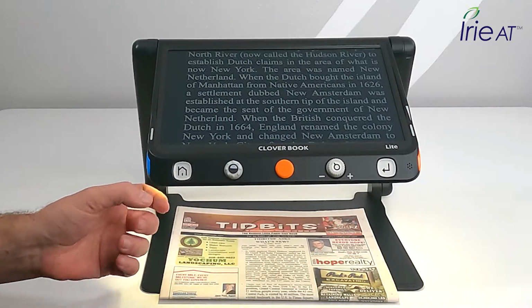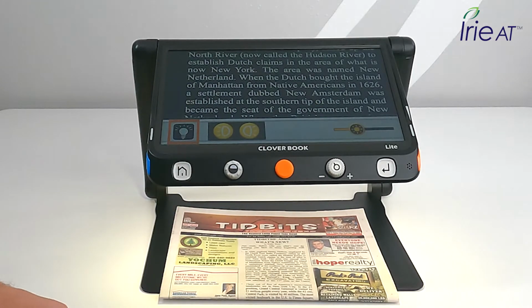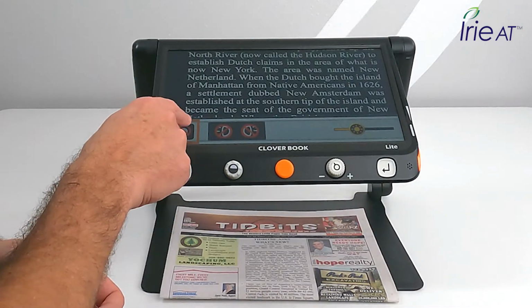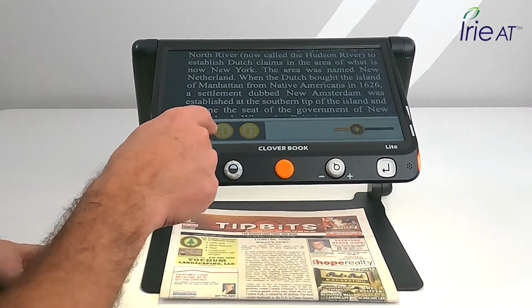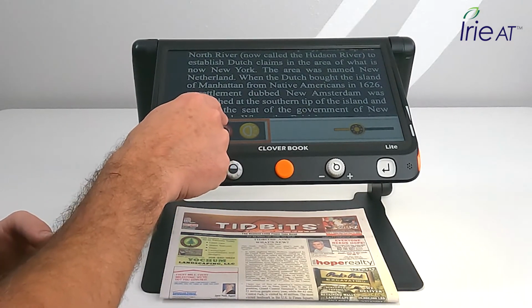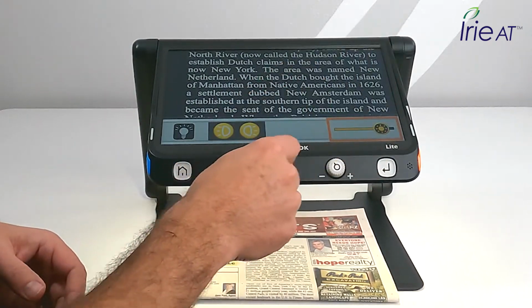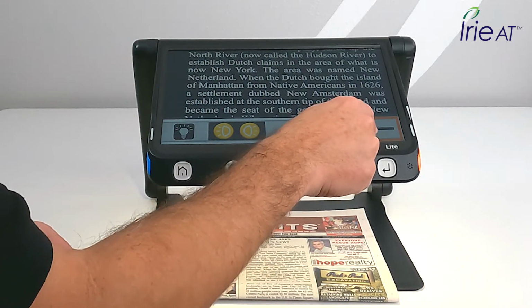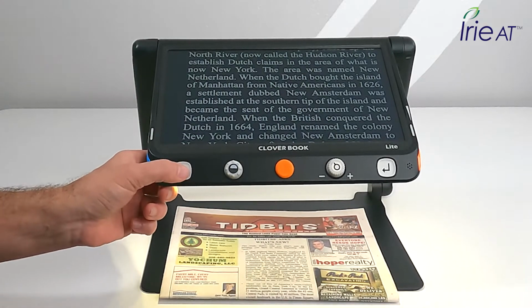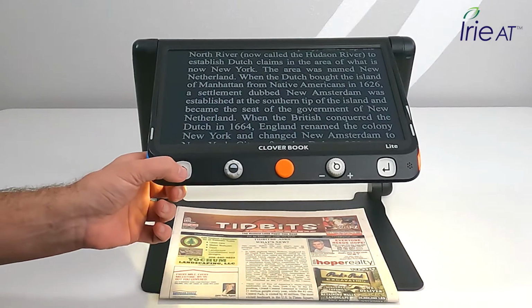So let's take a look at the home button here. I just have to press this button, it's the left side of the control panel. If I do a short press, it gives me some light controls. All lights off. I can turn off the lights. All lights on. I can turn on the lights. Bright light on. I can turn on and off the right or left lights independently. And then I can also change the brightness with a little slider on there. So that's if I short press the home button. And eventually that'll just go away by itself. A little thing pops up.